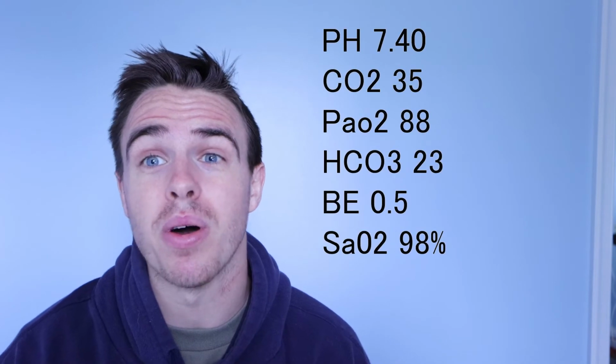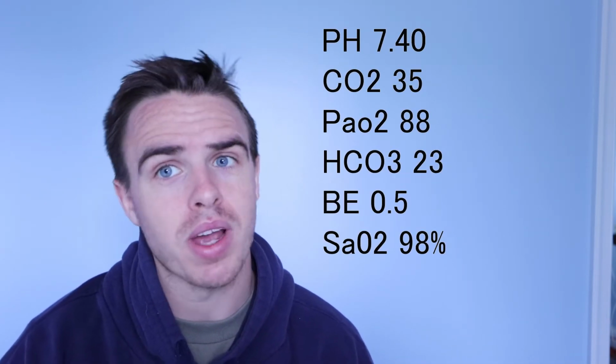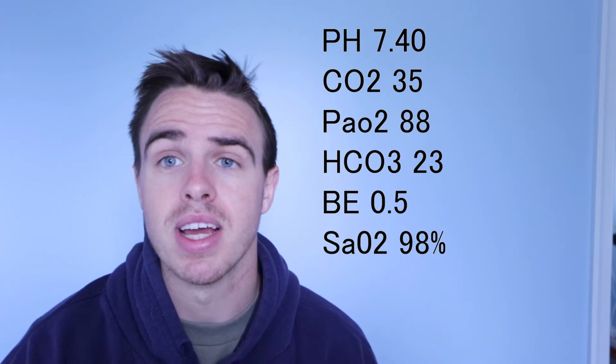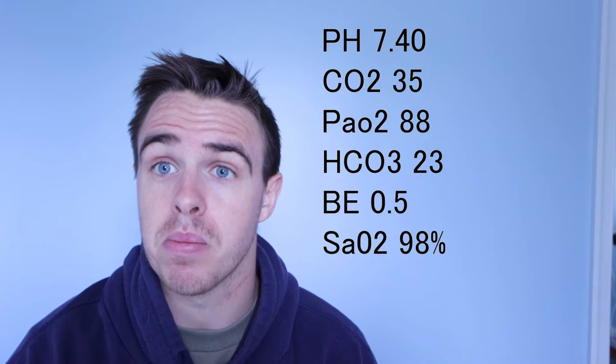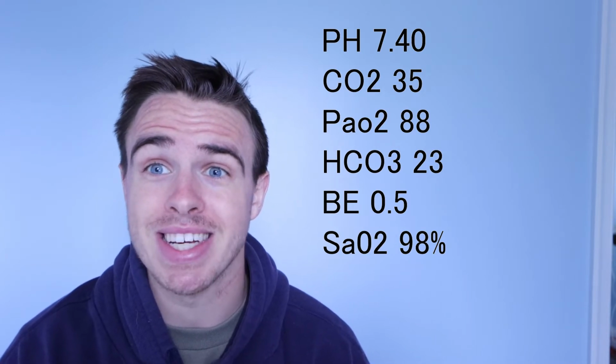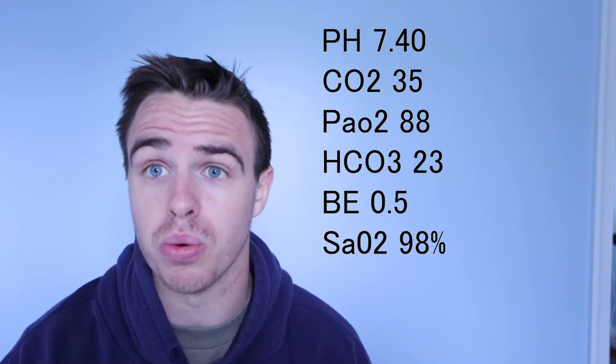So look at this here. You can see the pH is 7.40, which is perfect, right in the middle. Then you say, okay, pH is great, that's awesome. And then look at everything else. Okay, CO2 is great, oxygen is great, bicarb is great, base excess is great, and the oxygen saturation is great. So this ABG is normal, so we're good.